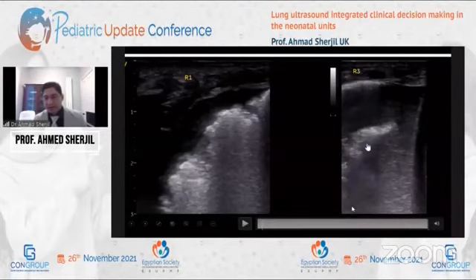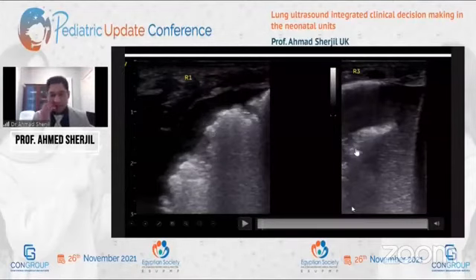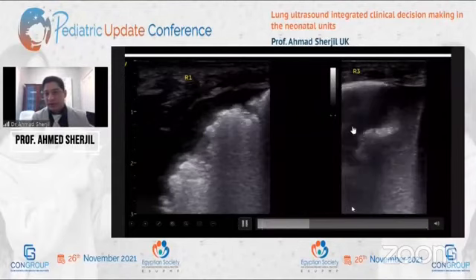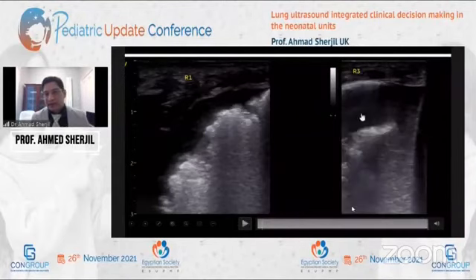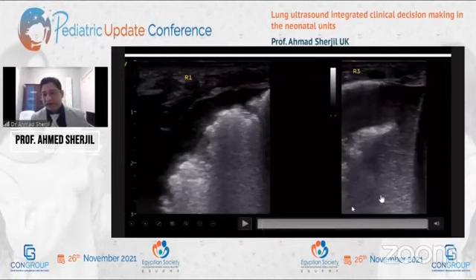So it has also almost become a tissue, visible as a tissue to the ultrasound. Usually the scan sees the lines, but here it's so solidified that there's so much blood here. So lots of hemorrhage, but also see the fluid around it. There is so much debris floating around it that it cannot be a straightforward pleural effusion.